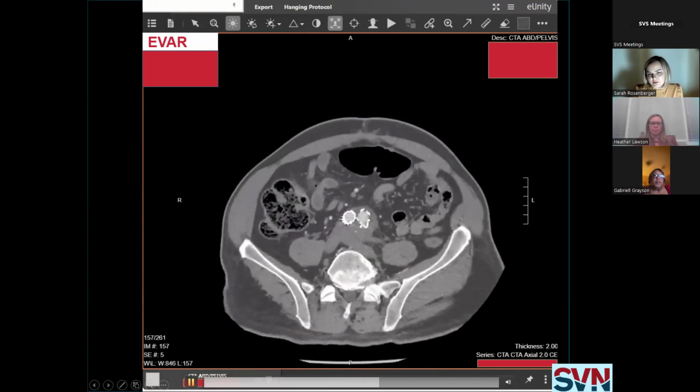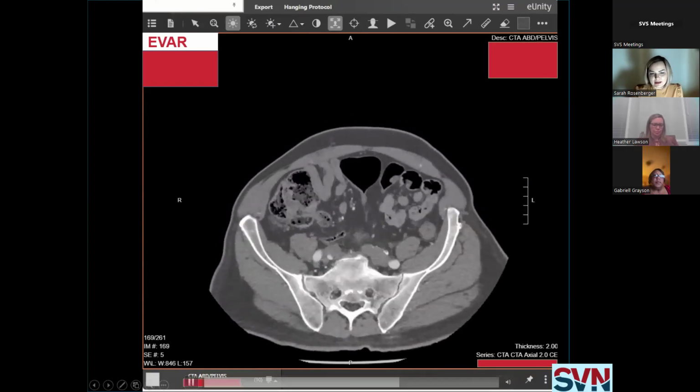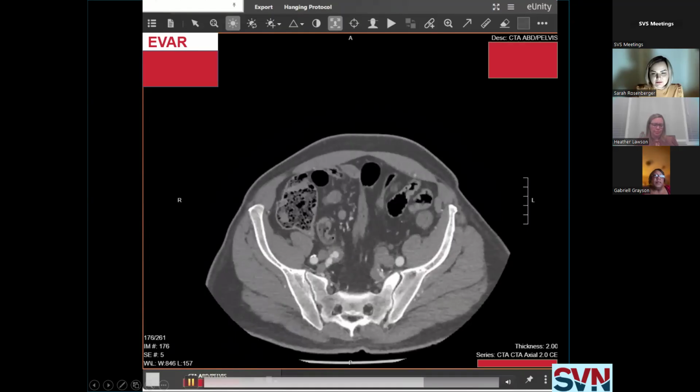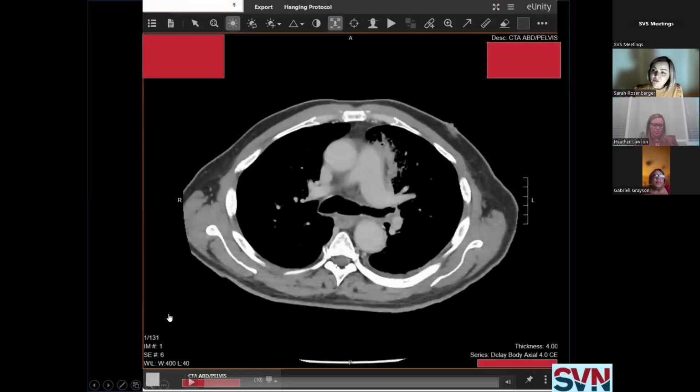So you can see this playing out all the way down. This patient does have a small internal iliac artery that we're watching. Maybe one day we'll get an extension. And then as we talked about, the patient gets that first run through that's dry, that second run through that's timed with arterial perfusion, then you wait about 3 minutes and run the patient through the scanner.